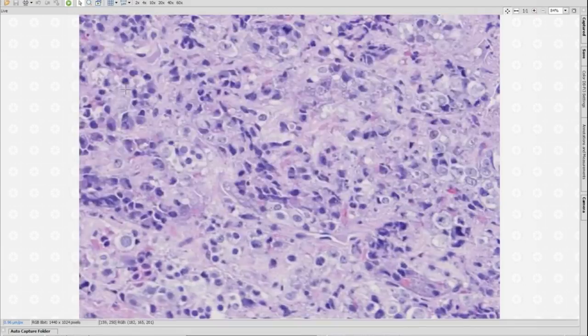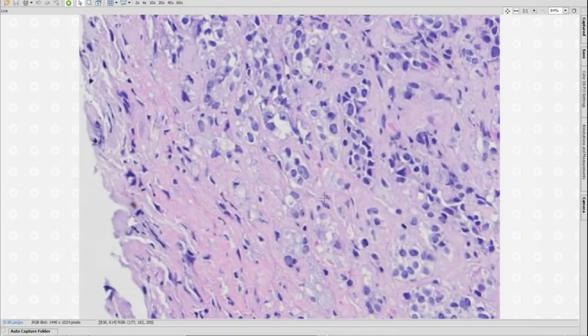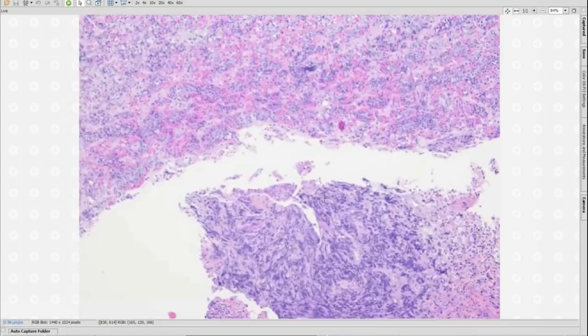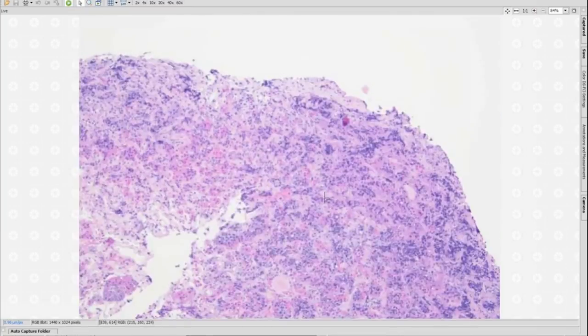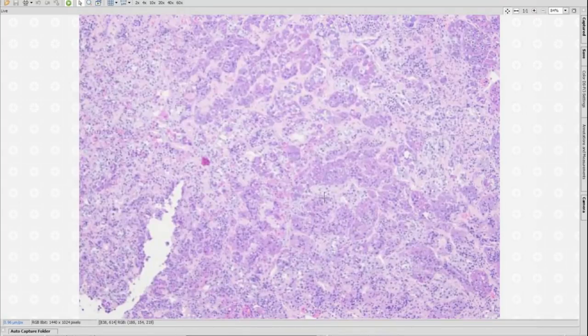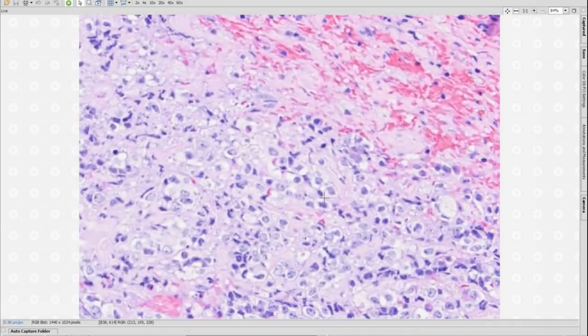And essentially, you have some overrun areas here. These are probably residual adenohypophysis, probably some corticotrophs, overrun by these cells with more eccentric cytoplasm. Here is more of the normal, non-neoplastic hypophysis. And here again, in contrast, you have these cells.